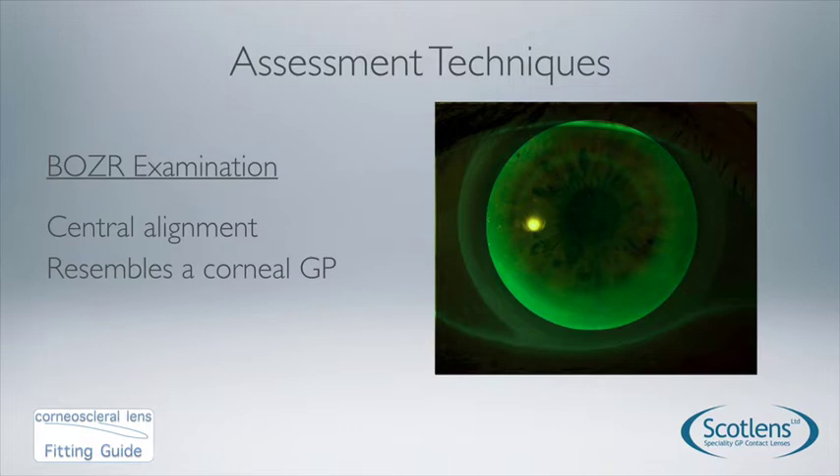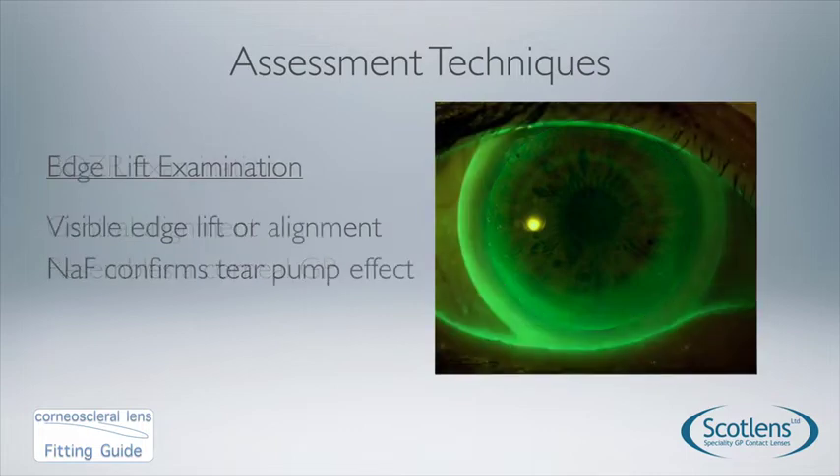The central zone resembles a corneal GP — we want alignment centrally going to limbal clearance at the edge of the 10mm zone in both the flat and steep meridians. The fact that we put the lens into the eye first and then instil fluorescein means we have a tear pump, so there is tear exchange going on underneath the contact lens and the lens is not bound or suctioned on too tight.